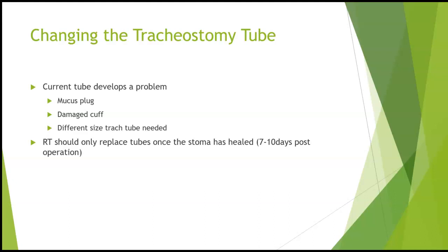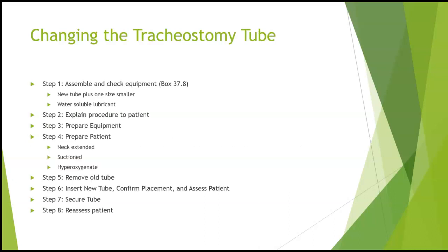You as a respiratory therapist will replace trachs in your career, but we only do it after the trach is considered established. So once that stoma site is healed, that surgical site is healed, typically that's about 7 to 10 days post-operation. For changing a tracheostomy tube, we want to make sure that we have emergency equipment available. That's first and foremost.